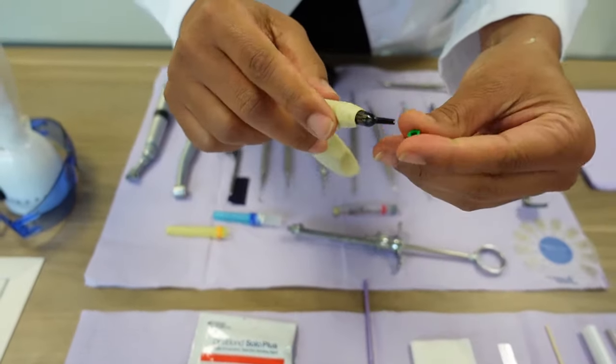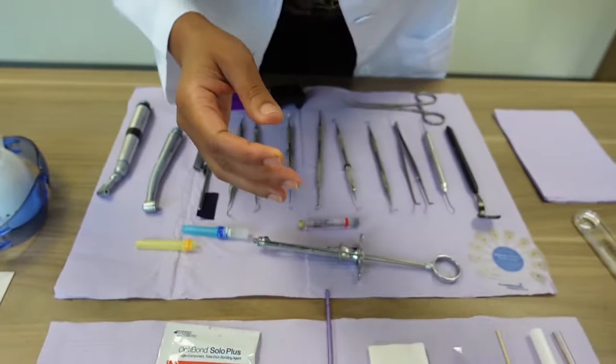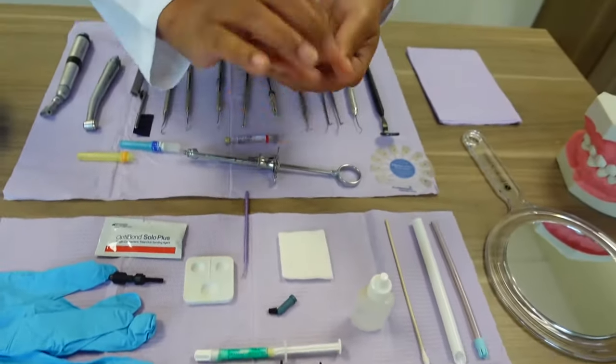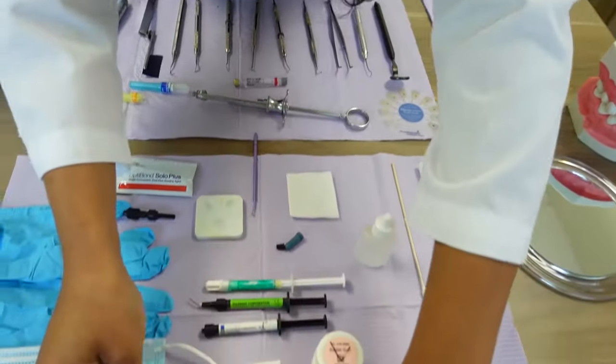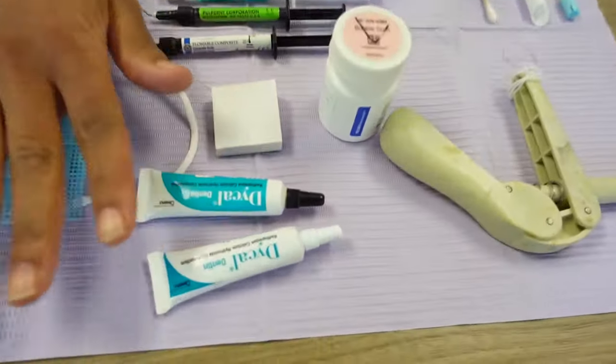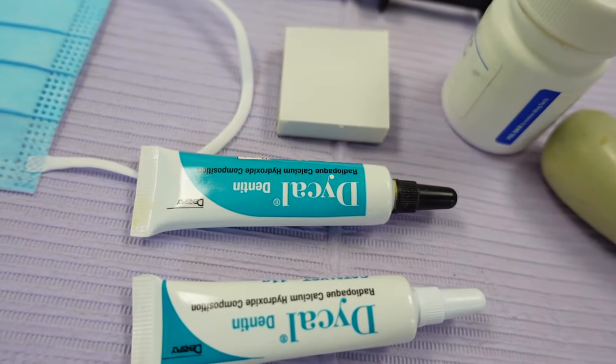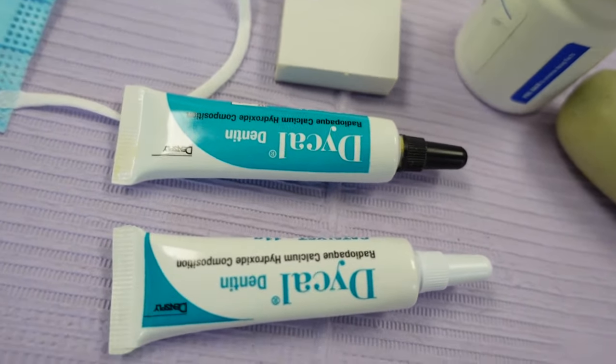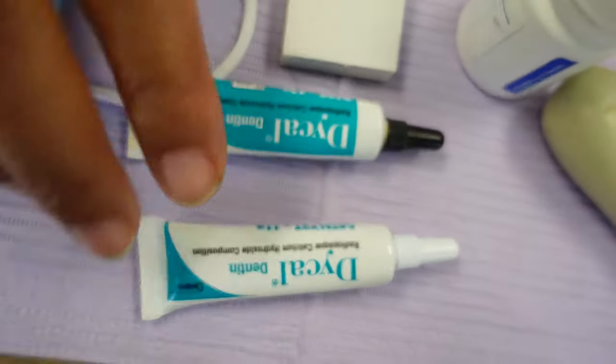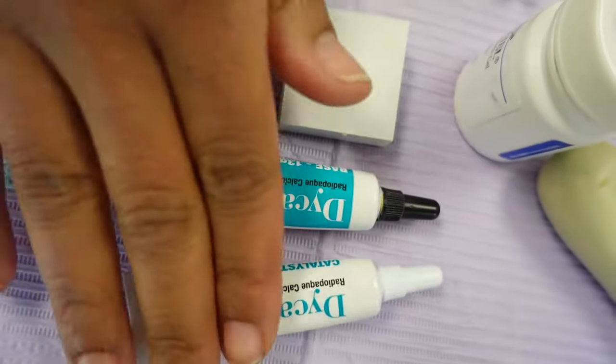This right here is actually called Dical. Dical can also be used as a cavity liner—it's a radiopaque calcium hydroxide composition. You have a base and you have a catalyst, and once you mix those together it will have a uniform color. That is used as a liner.